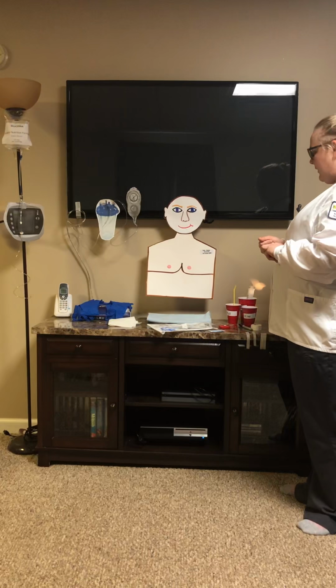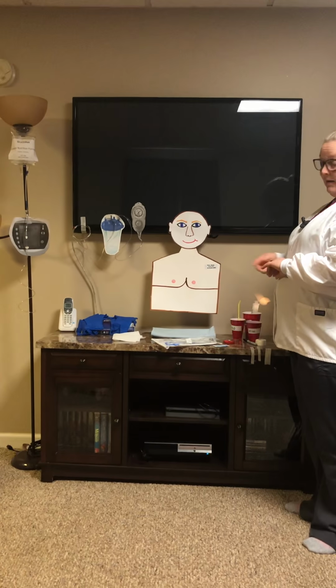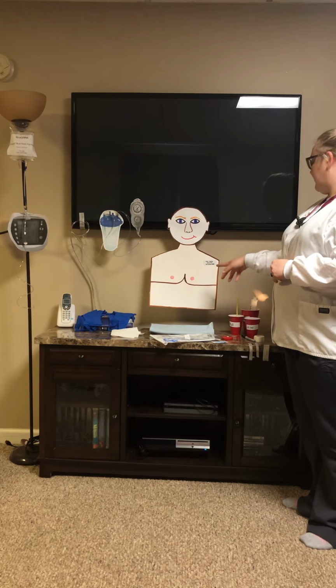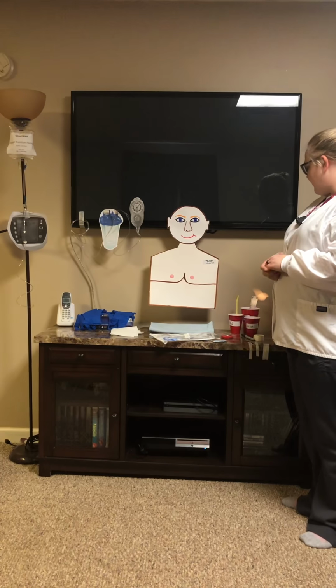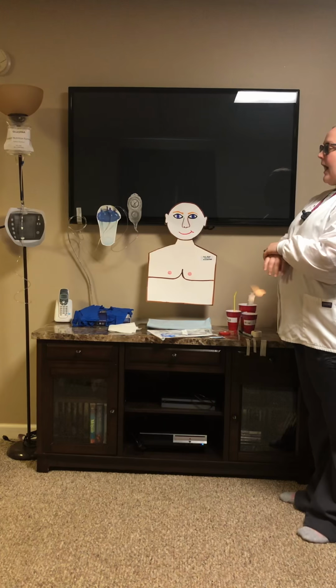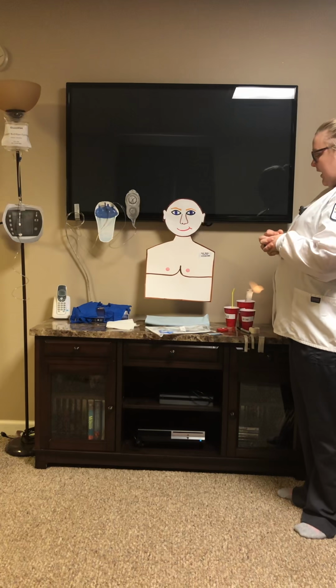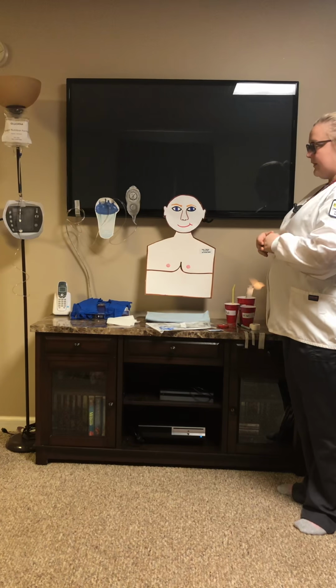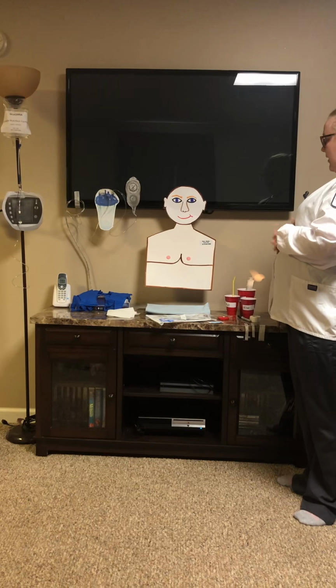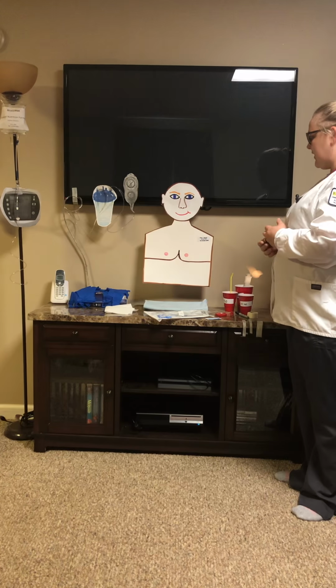I would identify my patient prior to assessing my patient upon entering the room, and he is Mr. John Doe, birthday 5/9/90, and that matches his medical records. I would perform hand hygiene and provide for privacy. He is alert and oriented. He is talking to me. I would assess his abdomen and respiratory status.